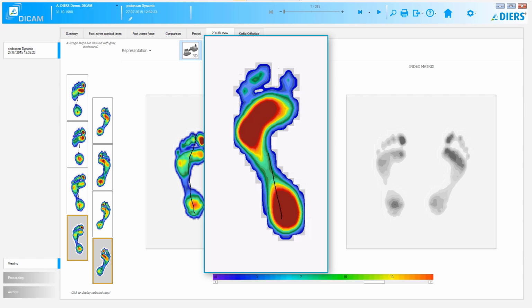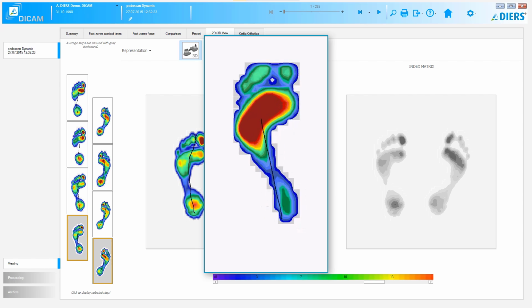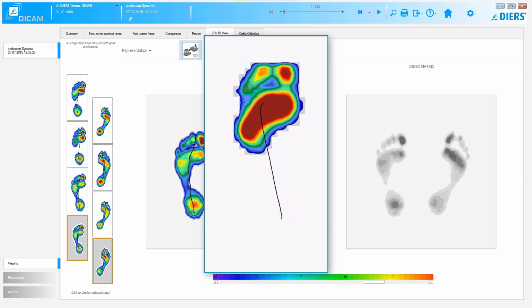In the later course of mid-stance, a slightly expanding pressure peak appears at the lateral forefoot, which is oriented medially in its development. Having reached approximately the anterior third of the metatarsus, the COP begins to represent the terminal stance. In this phase, the COP line passes into the metatarsal region, and the COP transfers the pressure analogously from lateral to medial in the direction of the hallux.